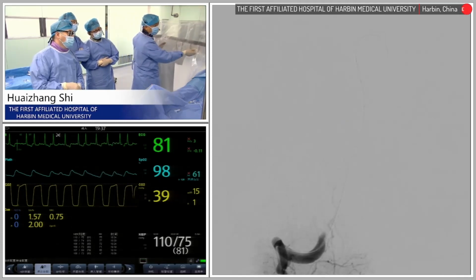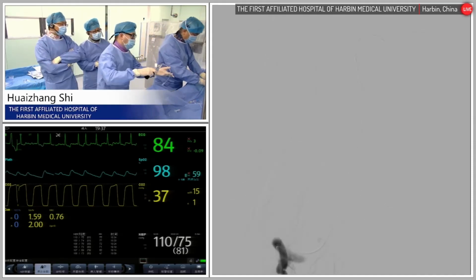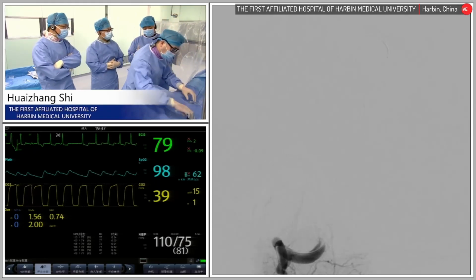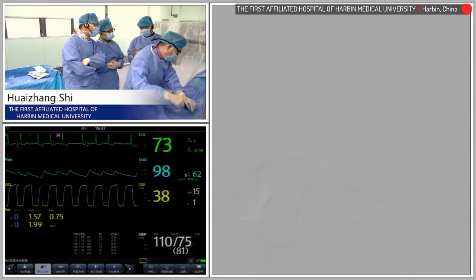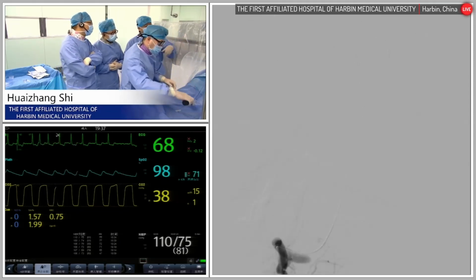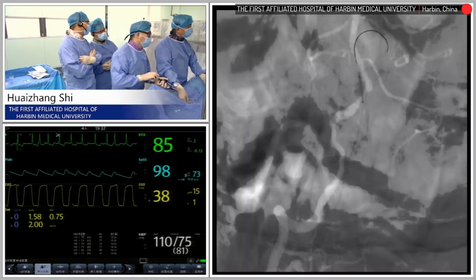Vasospasm. Okay. So are we going to give some medicine to treat this spasm? Yeah. Because the Fastunnel is stiff, very stiff. After that, sometimes there is spasm. So we just dilate directly.